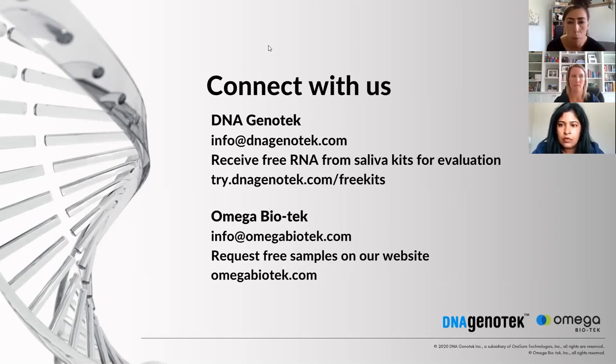Could the OMNIgene oral be useful in a point of care setting without an extraction step? Sorry, Laura, can you repeat that question? Sorry, I clicked it and then it was gone. But it essentially is, can OMNIgene oral be used in a point of care setting without an extraction step? So that comes back to, I think, the question that was asked earlier about how our workflow differs from those direct to workflows that are occurring at Yale or the University of Illinois. So we have not directly tested our saliva devices with those direct to assays. And that validation work would need to be performed up front before including our devices with those types of assays.